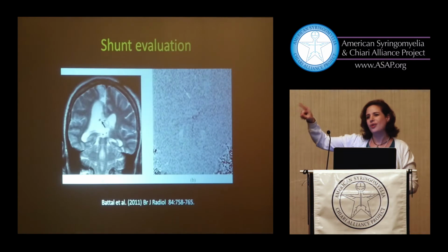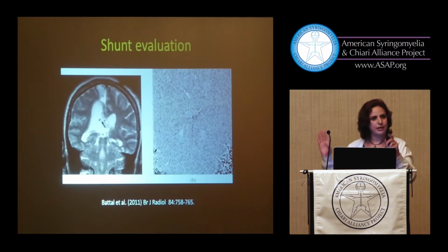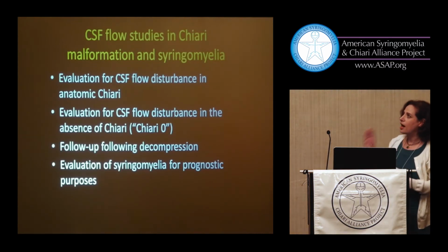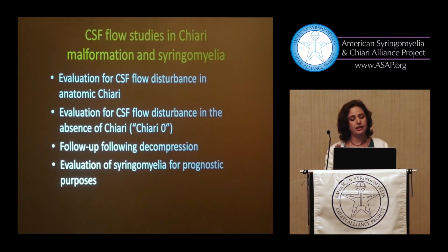No one had to go in and do anything to this patient, just stick him on the MR for 3 minutes, and you know that the shunt is patent. So just throwing that out, it hasn't been used very much, and I have a feeling I know why. If there's any interest, someone should let me know, and we can try to talk to Siemens and let me try to make it work. I didn't say that. So in the context of Chiari malformation and Syringomyelia, there are specific uses for this technique.